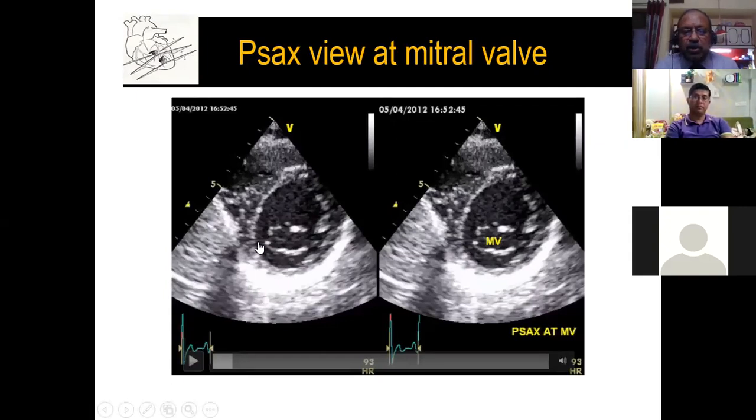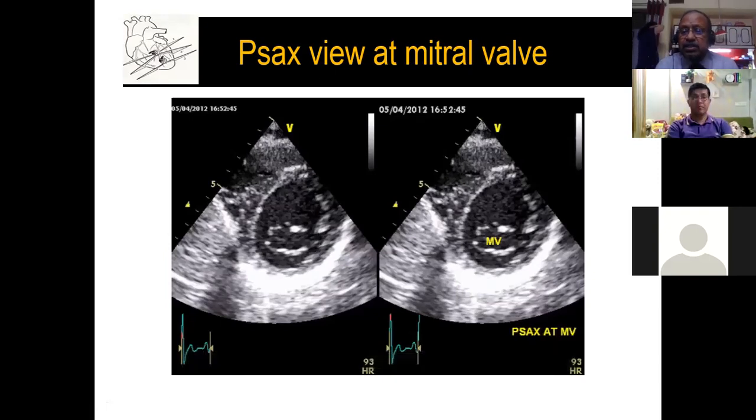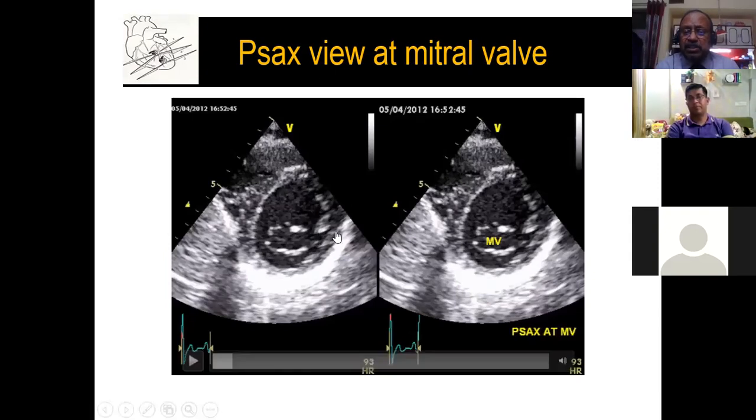On top of that, we want to do a planimetry. Apart from planimetry, we want to take up these patients for interventions. And persons who have been in this field know what we look for in interventions. We want to look at the commissures. Are they the lateral or medial commissures? Are they calcified?